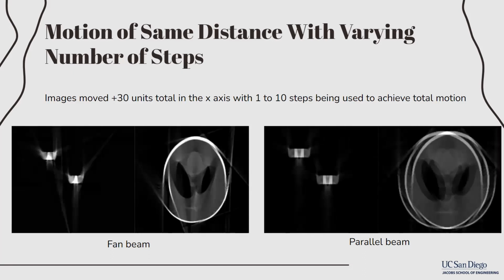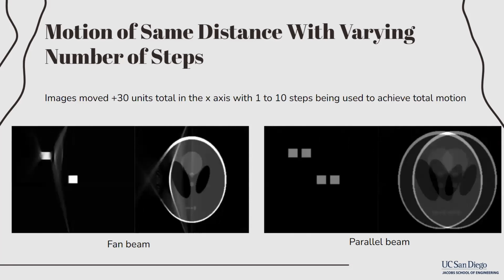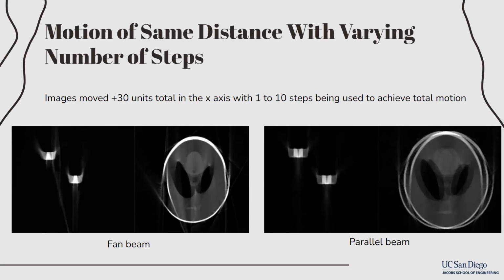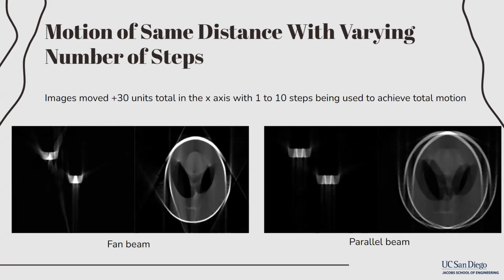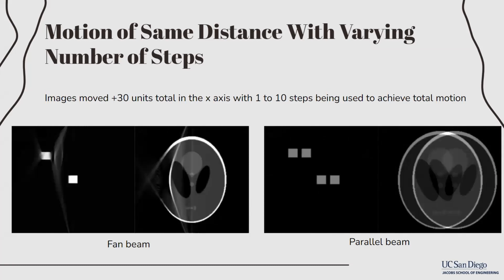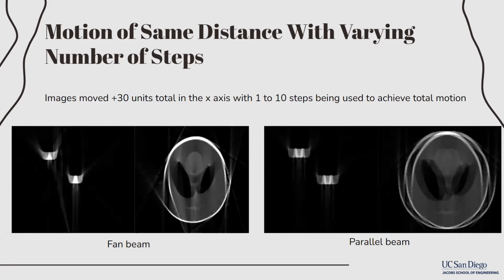the interval of scanning. As you can see, many of the artifacts are similar across what we've been seeing based on these reconstruction methods. However, there are slight differences across each magnitude of step that result in different artifacts, indicating that there is a significant effect of the motion and the graduality of the motion across the image, which would be interesting to observe and study further.